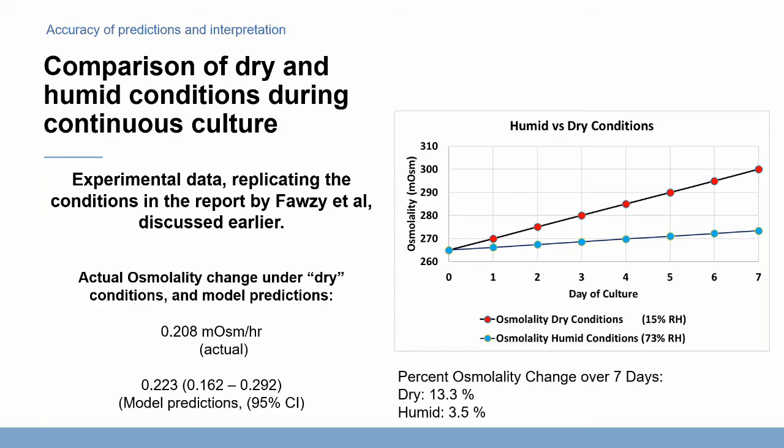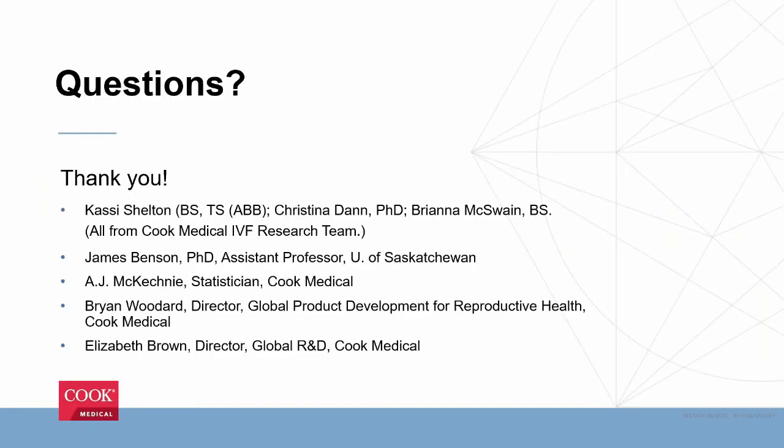I see that I've only taken about half the time, so maybe this will stir some discussion. But this kind of change is something that in the clinical setting you hope you don't have, because a pretty significant assumption was made when people began to use these non-humidified incubators. And that was, as I mentioned, that the oil layer would essentially protect the drops from significant evaporation. But what I and others have shown is that's in fact not the case, and particularly not under certain conditions of embryo culture.